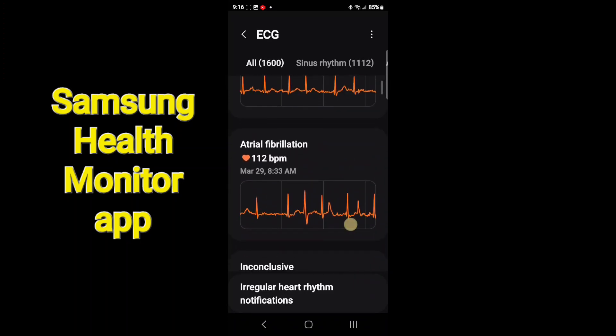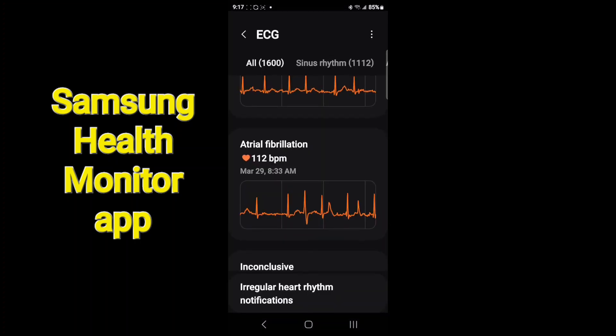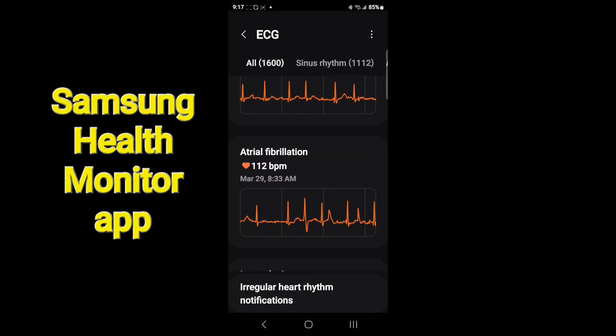Here's the one I just recorded — you can see it's pretty erratic. My average heart rate was 112 beats per minute, and everything looks pretty wacky. You can tap 'Share Report' to print it, email it to your doctor, whatever you want to do.